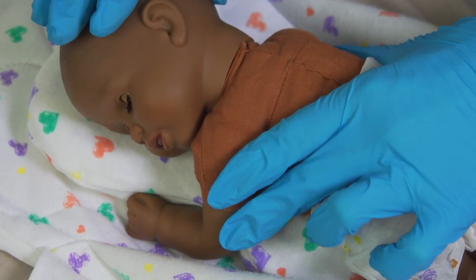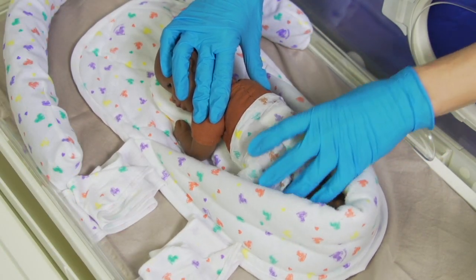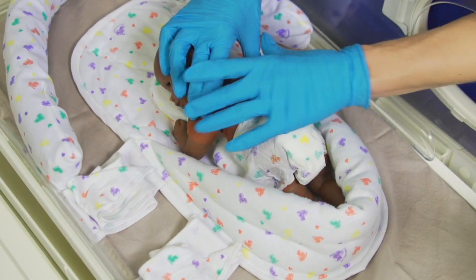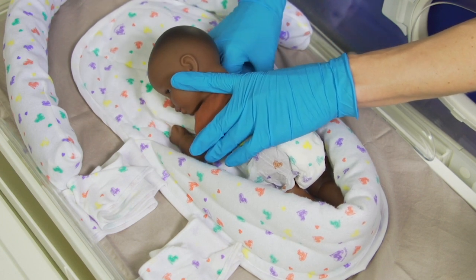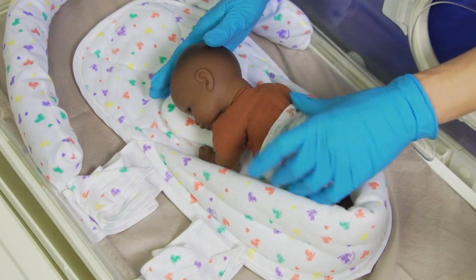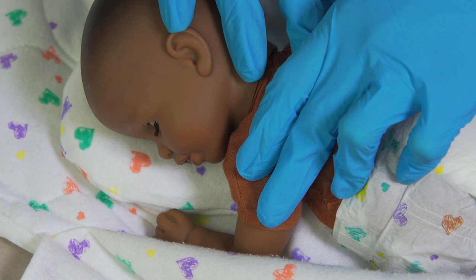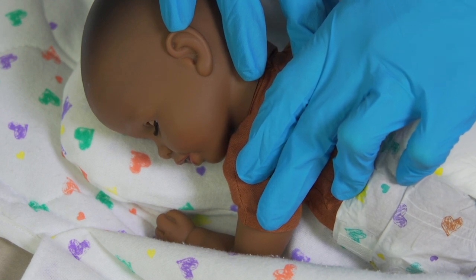Ensure that the hands are toward the mouth for self-soothing. Be sure the hips are rounded and the feet are placed in the Snuggle Up. The infant should be supported from the top of the head to the navel. The hips should be flexed. The elbows should be tucked into the indentation on the Prone Plus to support rounding of the shoulders and hand-to-mouth movement.